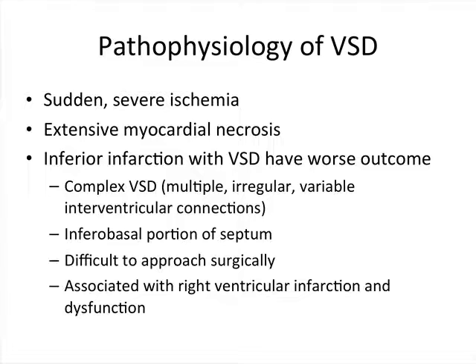Their VSDs are complex, with multiple irregular and variable interventricular connections, often involving the inferobasal portion of the septum. These ventricular septal defects are difficult to approach surgically and are associated with right ventricular infarction and dysfunction as well.